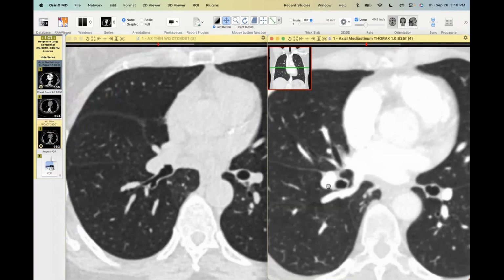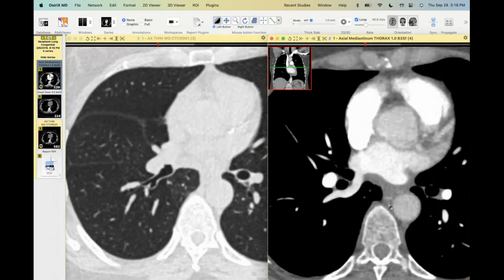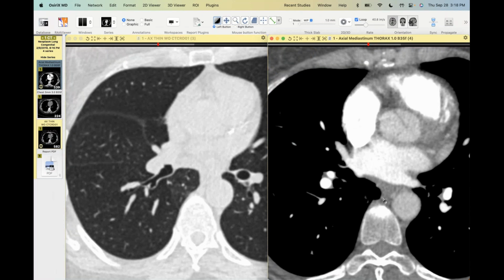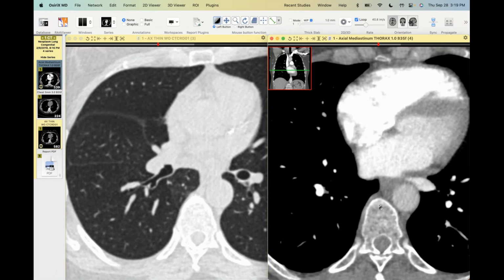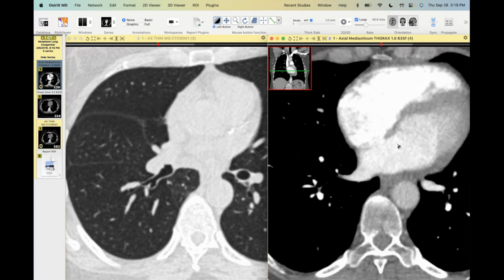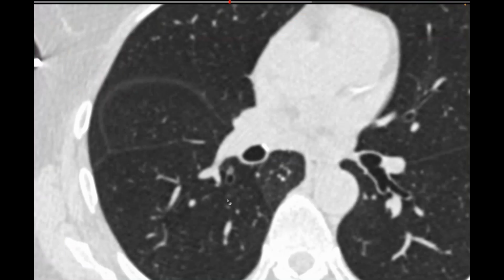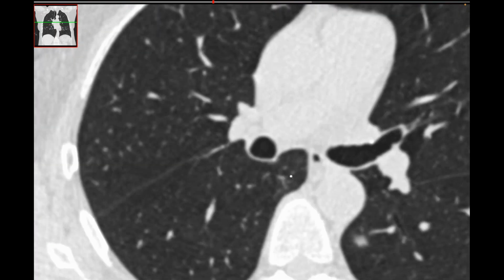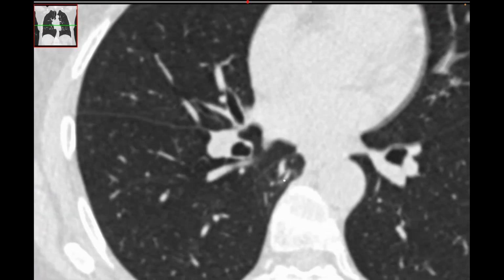If you look at the original contrast study from the outside hospital, it's a little thicker image. But this little vessel feeding this thing, I thought I could trace to an intercostal artery, like right here, clearly coming off the descending thoracic aorta. I looked down and didn't see anything arising from an inferior phrenic or the celiac or anything in the abdomen. So it looks like it's got a systemic feeder. And when you really look at it, it's hard to trace an airway to this area. It's got some weird partial fissure there, but there are no airways in that area.